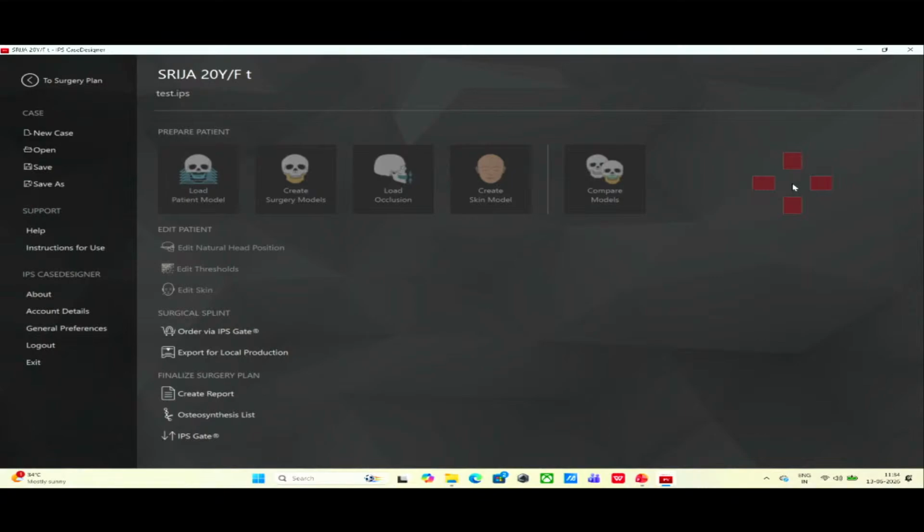Okay, and that was just a quick run through. We will guide you step by step again, and we will be in the hall to guide you as you do the planning yourselves.